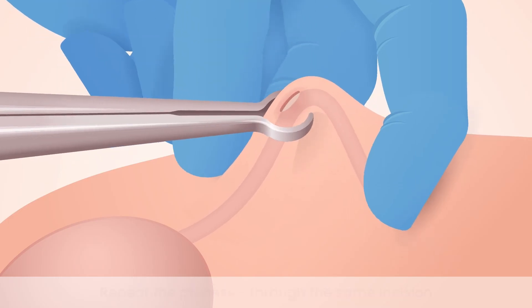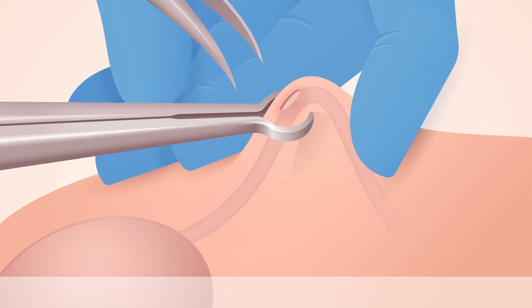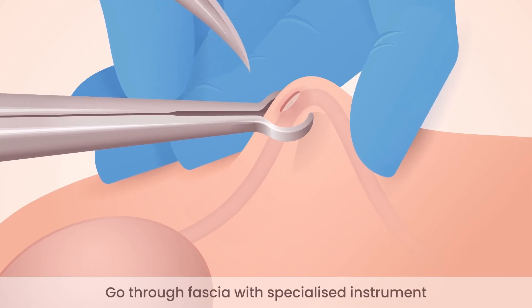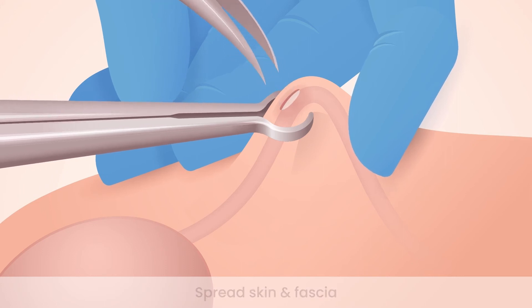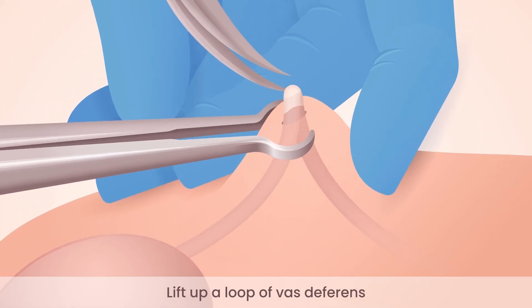The right vas deferens is manipulated underneath the skin incision and isolated with the ring forceps. The same instrument is used to go through the fascia, spread the fascia, and a loop of tube is brought out through the fascia and skin.